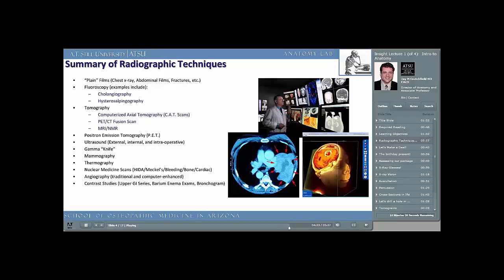Some radiographic techniques, such as lymphangiography or lymphoscintigraphy, allow the radiologist or a surgeon to look at the lymphatic system. It's used today in breast cancer imaging, a technique called sentinel node biopsy. And thank God an outdated test called pneumoencephalography, a barbaric technique to look inside the brain and the ventricles, to look for brain tumors or blockages of the flow of the cerebrospinal fluid out of the brain causing a condition called water on the brain or hydrocephalus, is no longer used. Even in the virtual anatomy lab, you'll see some techniques of recreating 3D imagery of the human body.